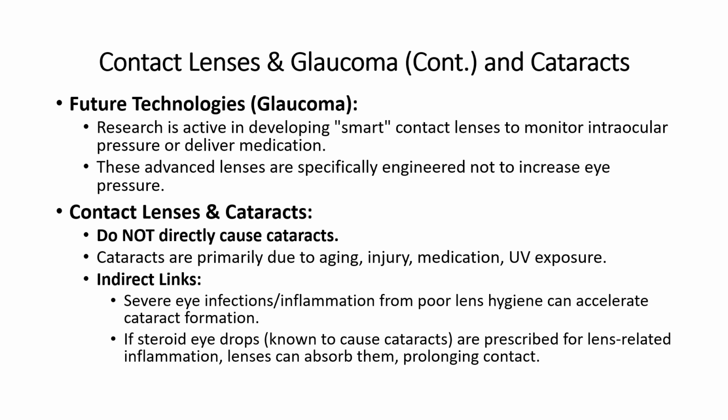Continuing our discussion on glaucoma, it's interesting to note that research is active in developing smart contact lenses designed to continuously monitor intraocular pressure for glaucoma patients, and even drug-delivering contact lenses that can release medication slowly. These advanced lenses are specifically engineered not to increase eye pressure, but rather to aid in its management or monitoring.